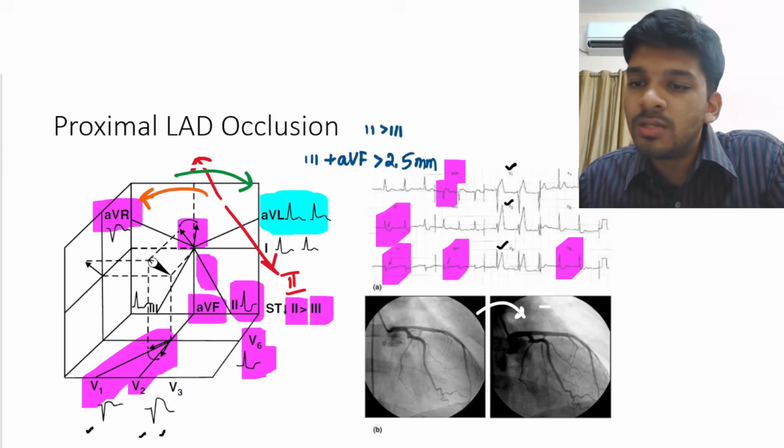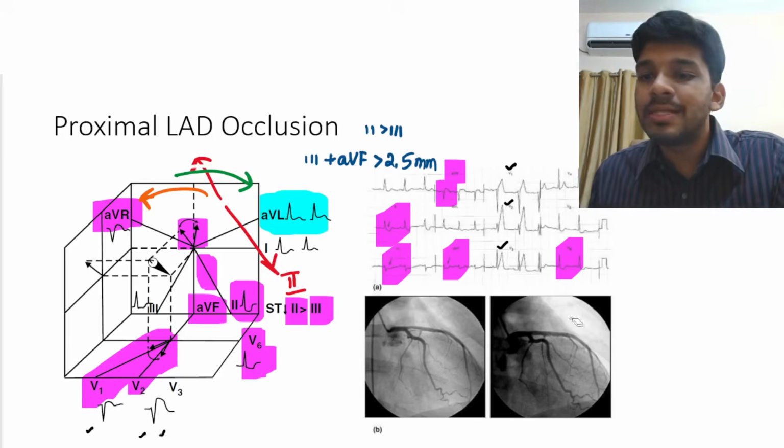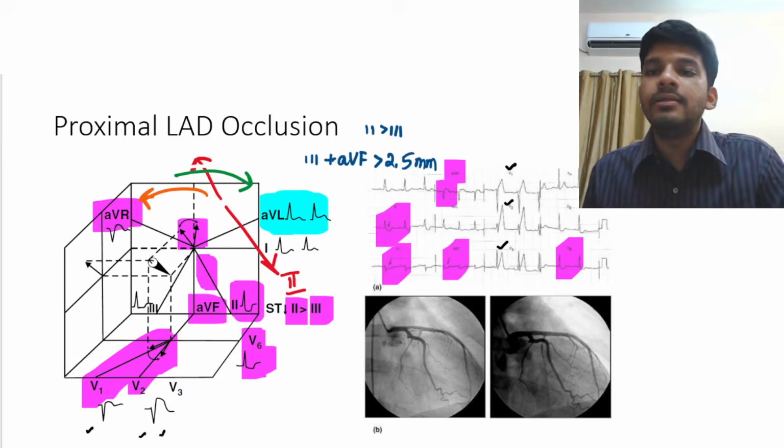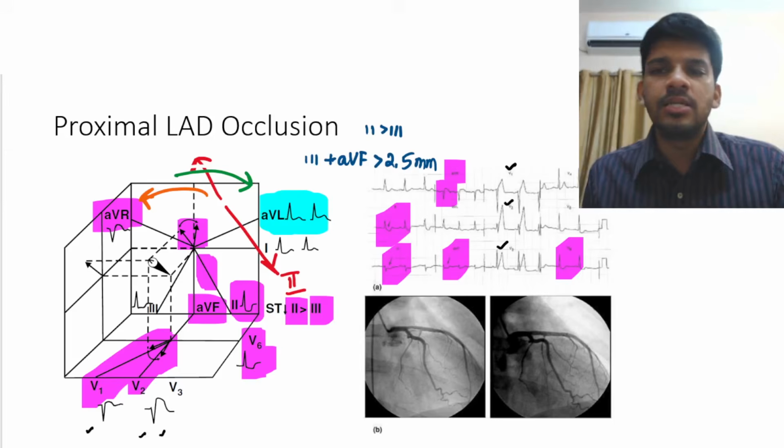So this is sometimes mentioned. This is a TIMI flow 3. So what happens is there are reporting methods of the success of reperfusion, and the TIMI is one of the classifications that is used.